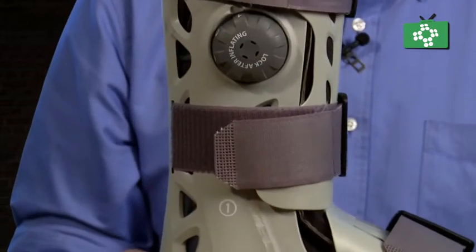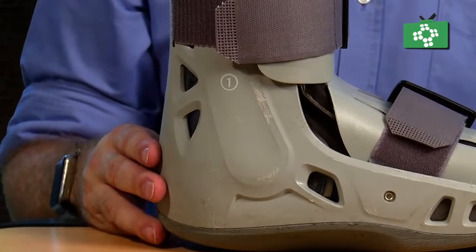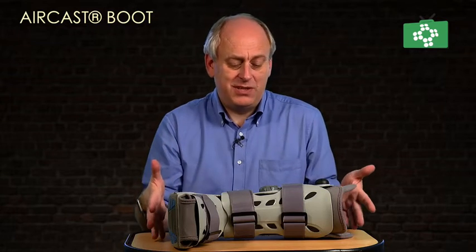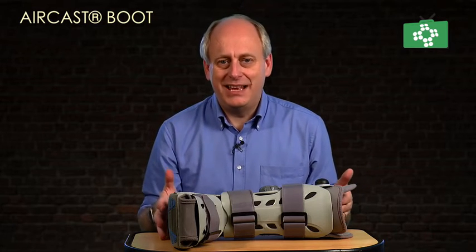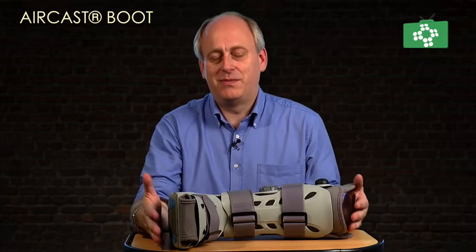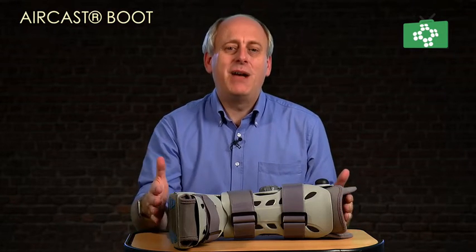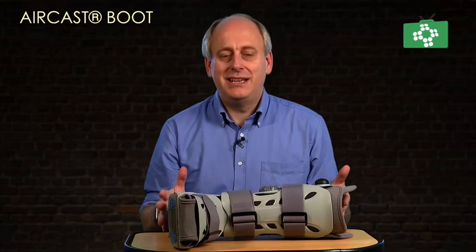These boots are designed to be weight-bearing. Some people will be able to weight-bear, others won't — it depends on the injury. The Aircast boot is not really something you keep in a first aid kit; it would be prescribed by a doctor. However, there may be certain situations in remote settings where you do need to splint an ankle or keep a foot injury protected, and something like this could be very, very useful.